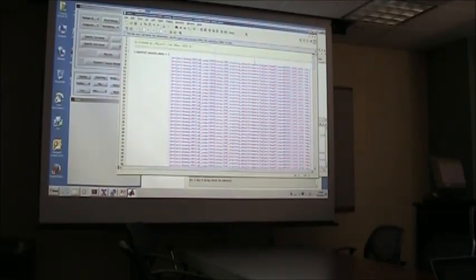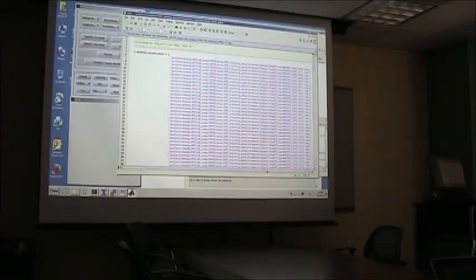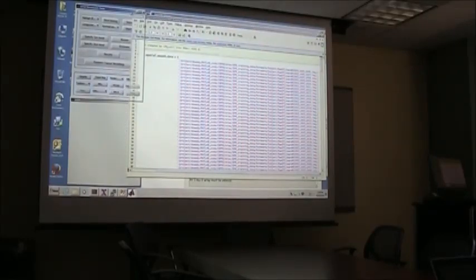In fact, that's one of the things that we do to speed up some of our analyses, especially, like I mentioned, for this twin data set where we have hundreds of subjects. If you want to run this stuff fairly quickly, you really can't go to each of these little steps one by one for every subject. It's going to take too long. And this is one way to do it.